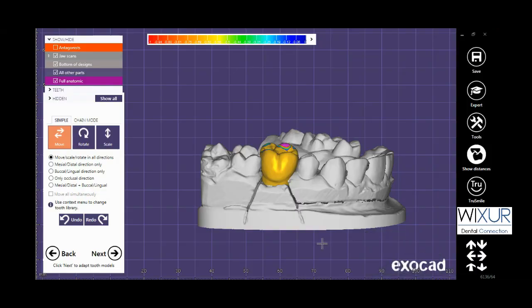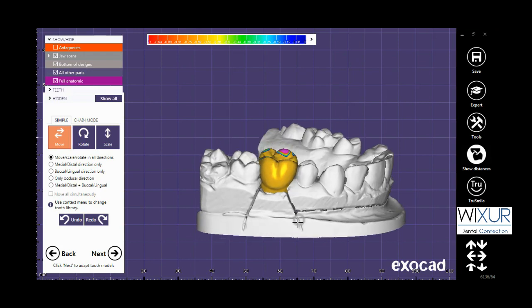Hello everybody, this video shows how hotkeys are used in exocad software. Using them helps you design faster and easier.